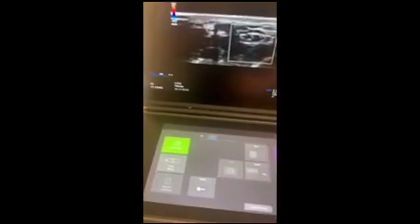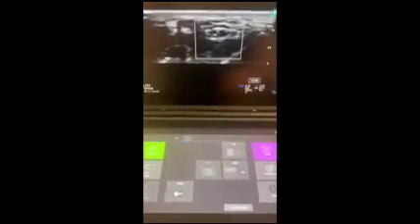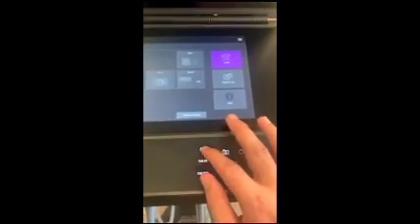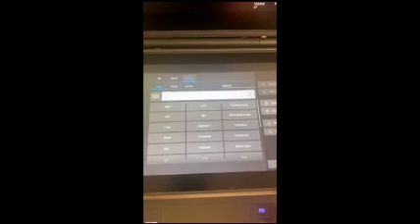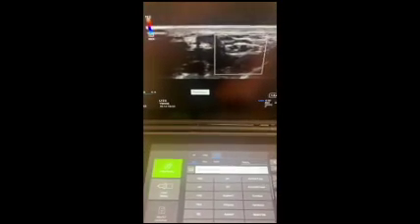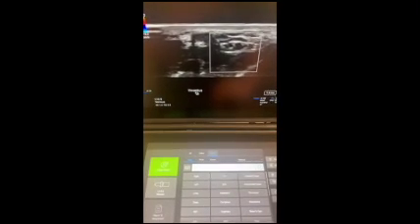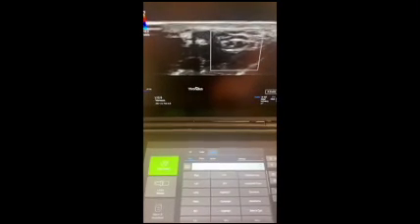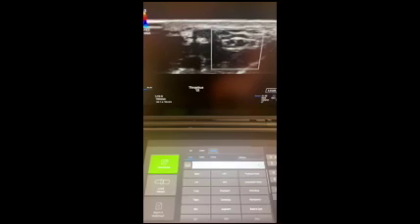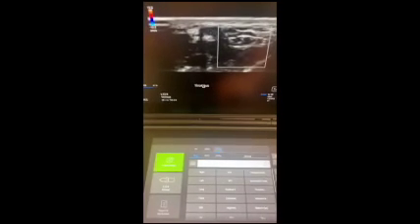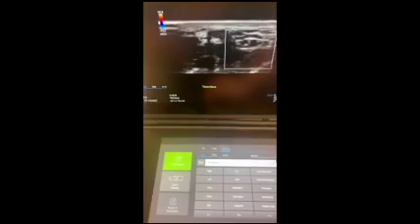Once you've found where you like, if you would like to annotate the screen in any way you can. We can click here, ABCs, and it'll show us some preset options which may or may not be relevant. Here, we can click thrombus for the purpose of education. If you'd like to click on it, you use the touch screen, hover over and click select.